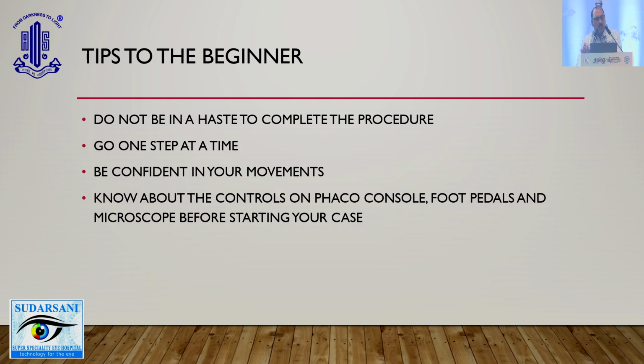Tips for the beginner is, do not be in a haste to complete your procedure. Go one step at a time, be confident in your movements, and first and foremost, know about the controls of the phaco console, foot pedals, and the microscope before starting your case.